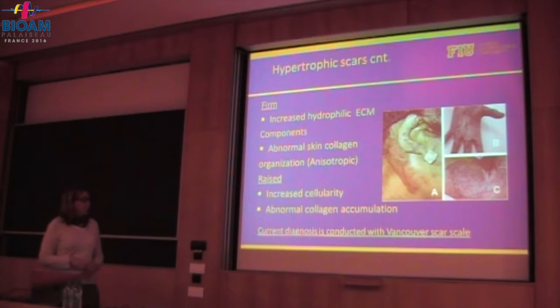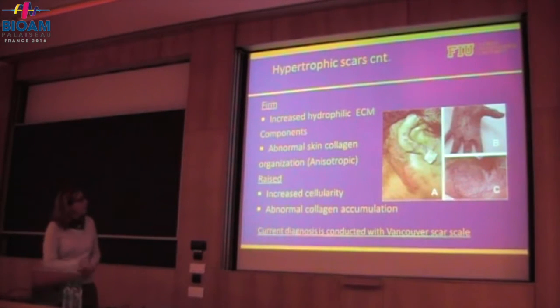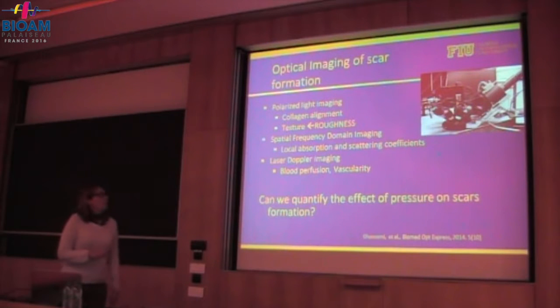So where things like, again, the firmness, the height, the color of the scar is evaluated by a physician. So it's a very subjective type of scale. So we built a system to try and quantify this Vancouver scar scale to provide quantitative metrics.